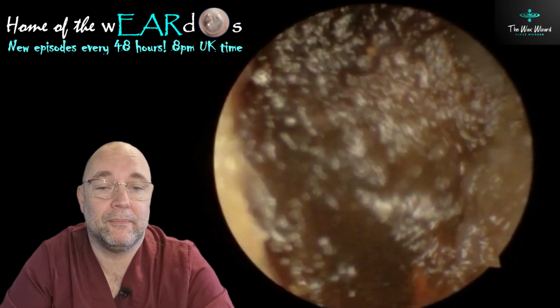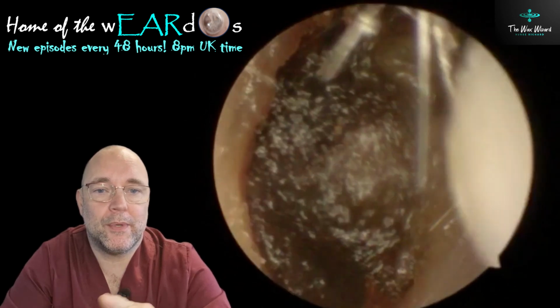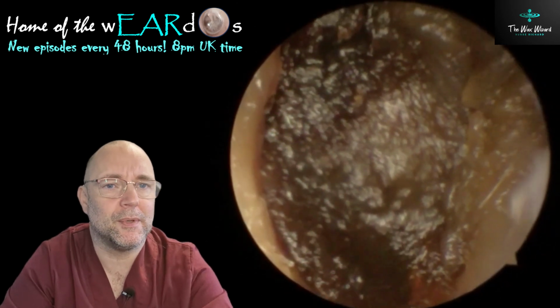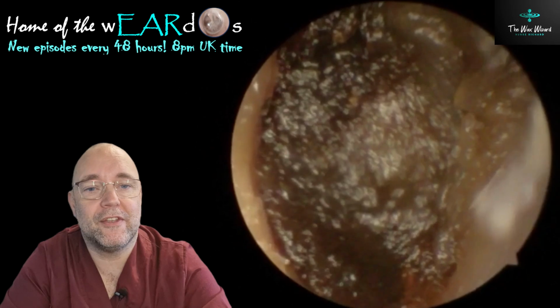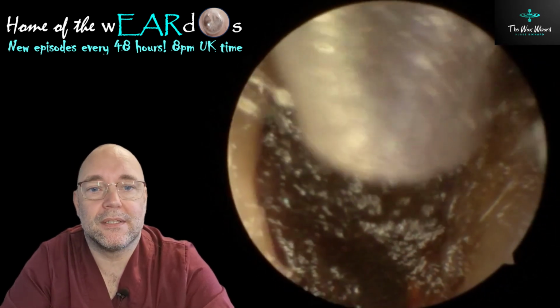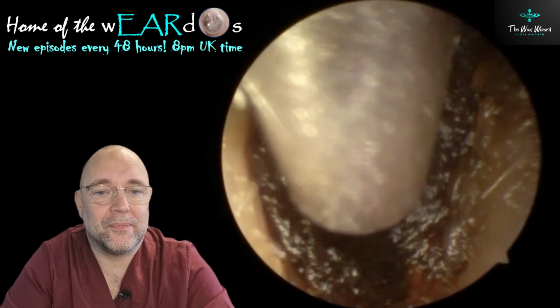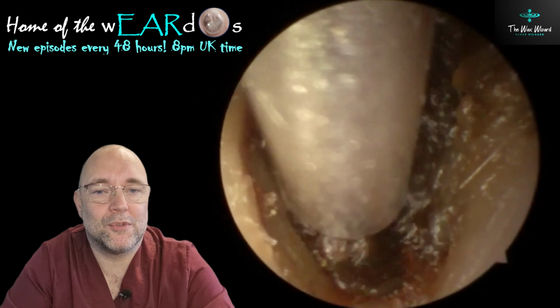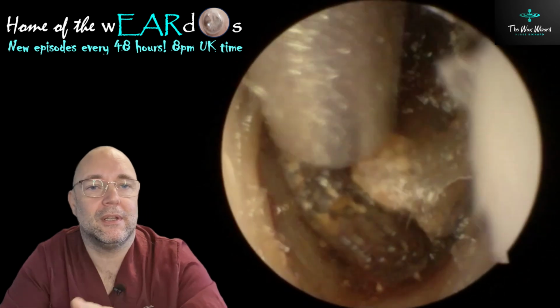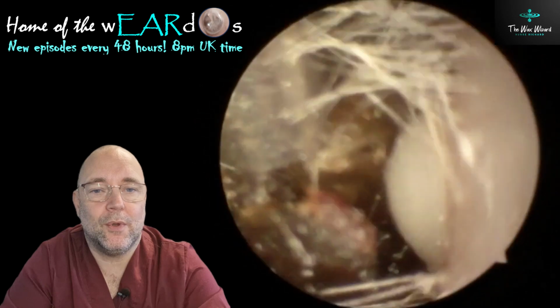I've never seen any cotton wool made out of red. No idea. The last one here, now this lady came to see me. There is a bit of a suspicious little dent in this one. Whether she used a bud, I don't think she was a hearing aid user. It's been a while since I recorded this, so forgive my memory. I am nearly 50 now, this year in fact. So yeah, you start to forget things. I suspect she may well have poked something in there because it was a bit deeper down than it should have been. Like I say, you get this telltale little indentation in it.